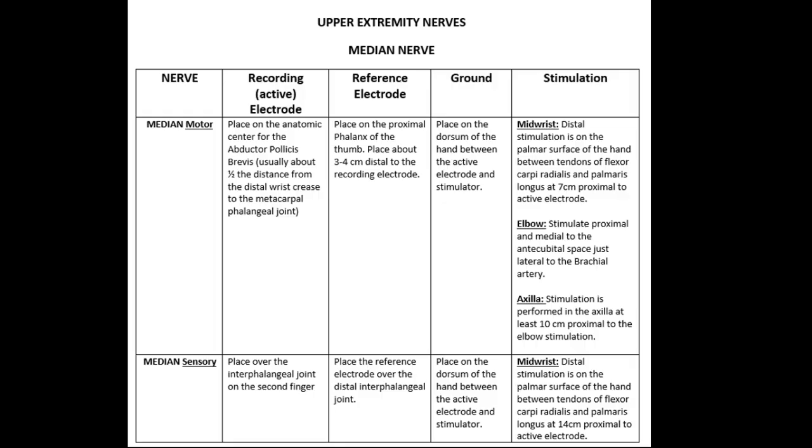Okay. And don't try to stimulate too much with the current, because then you will be getting other nerves in the locality of the recording electrode. Especially if you're doing the median sensory, you may get the median motor study coming in too. But again, don't stimulate too much for the sensories. Go by 3 to 5 milliamperes. Don't stimulate too high. Above 30 is too much for sensory.